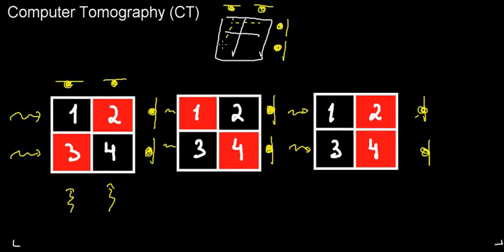So I know that somewhere here I'm going to have absorbing dense material, but I can't really be specific as to where it is, because if I radiate the y-axis on this square as well, I'm going to get one attenuation here and one attenuation here, and essentially these two squares are going to look the exact same to me. I can't resolve the differences between them.